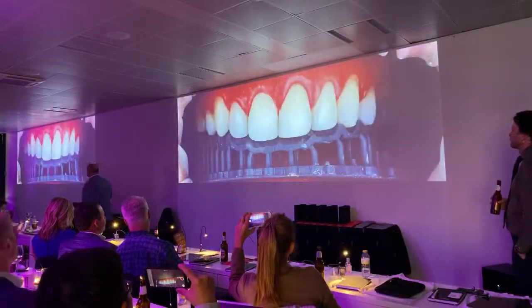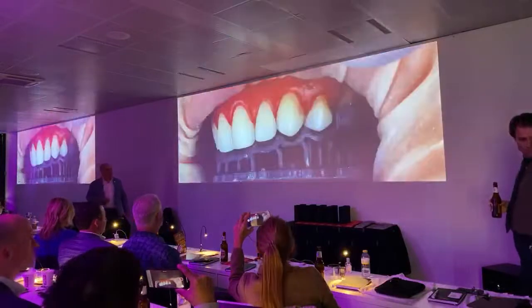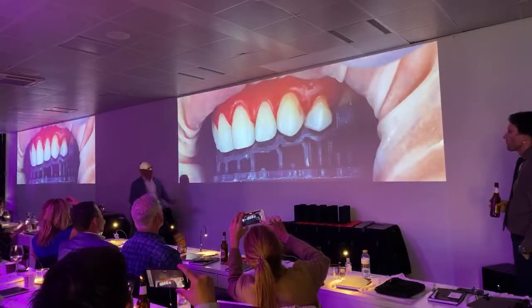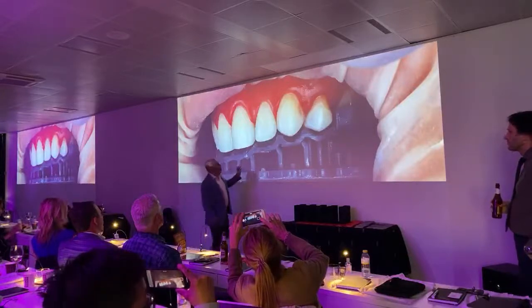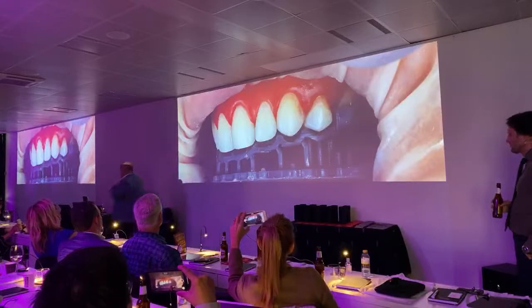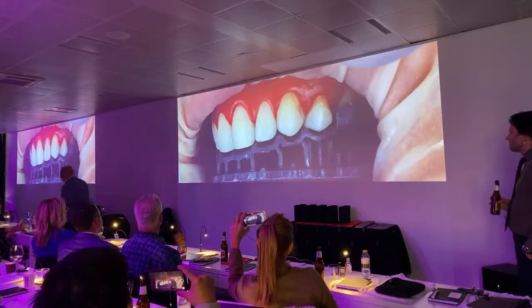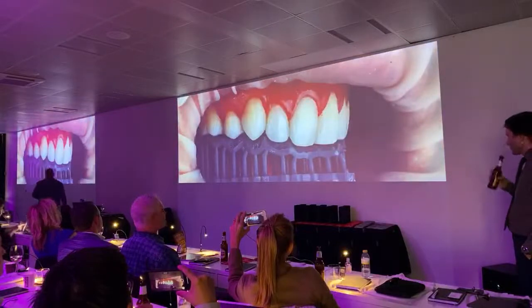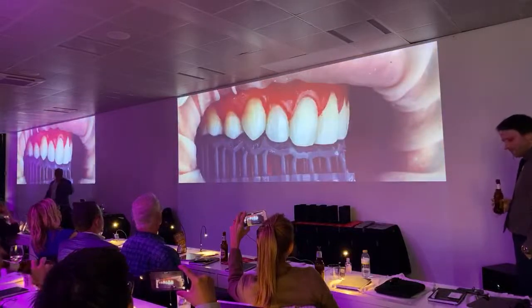So we can see the clearance. Right? So I'm sure if you use these guides, I don't need to change the project for the final restorations. We can keep the same size of the teeth.